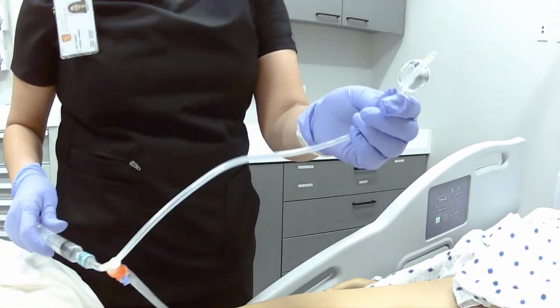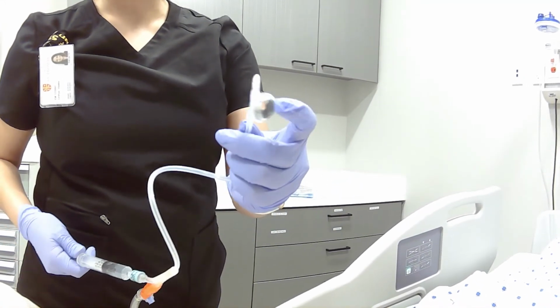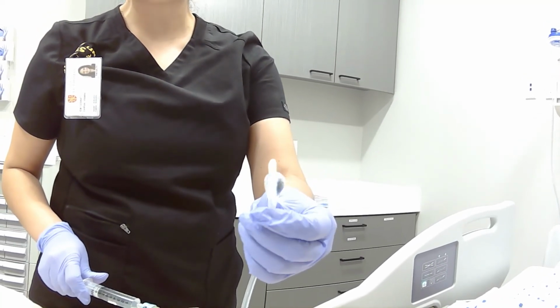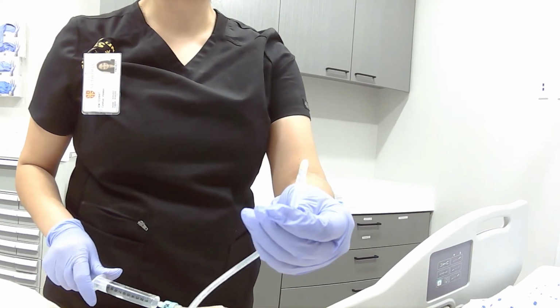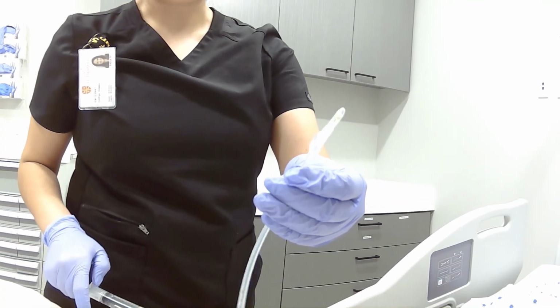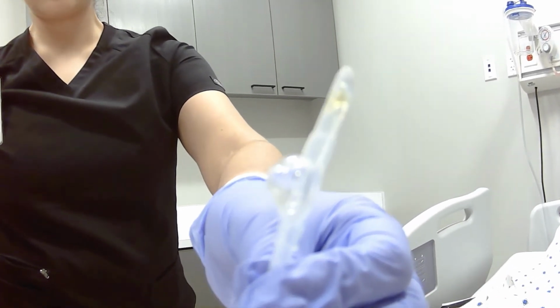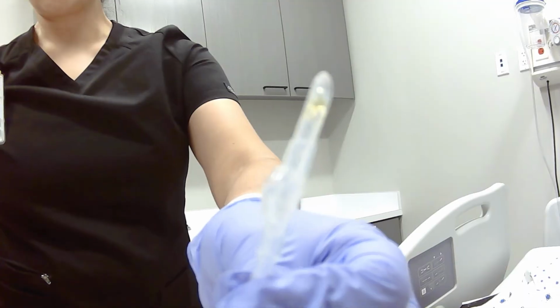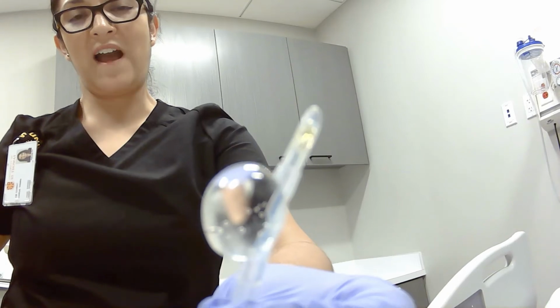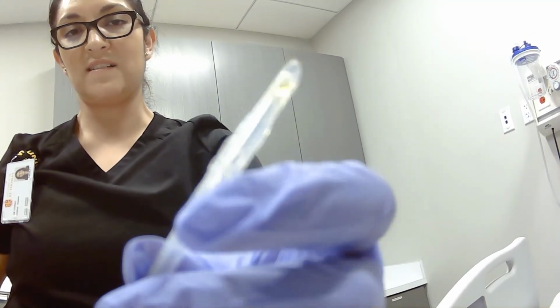When you remove it, you're looking at the tip to make sure it's intact and hasn't burst, because if the balloon bursts, it will come out even when the patient sneezes or puts pressure to adjust themselves, like bearing down. You'll see the wrinkles that can be caused by the balloon. When you withdraw the water from the catheter tip too fast, it wrinkles, and then it can cause damage to the urethra as it's coming out.